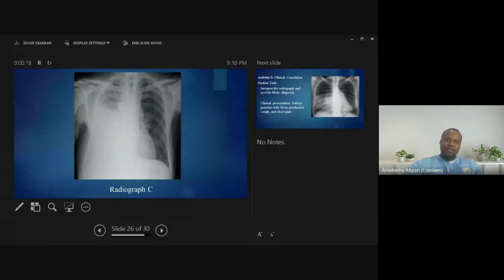Okay, I think the image is being shared here. Thank you very much. And these things can make you see them. We consider these things as pathologies or pathological patterns in pleural diseases. So you can have fluid, and by fluid, I mean it could be blood, which is hemothorax. It could be serous fluid, which is hydrothorax. It could be pus, which is empyema.